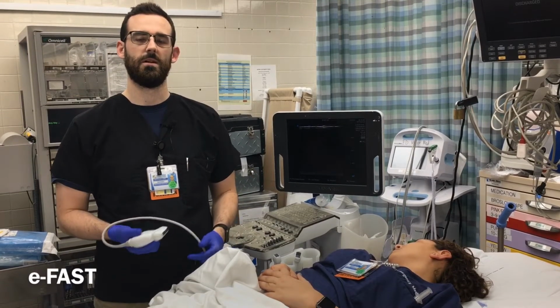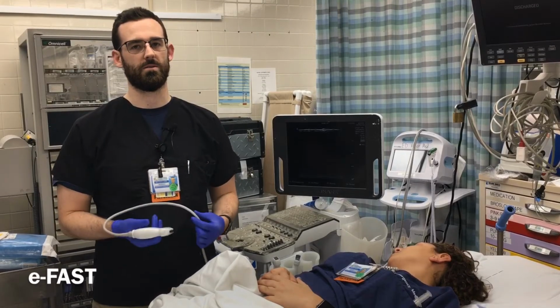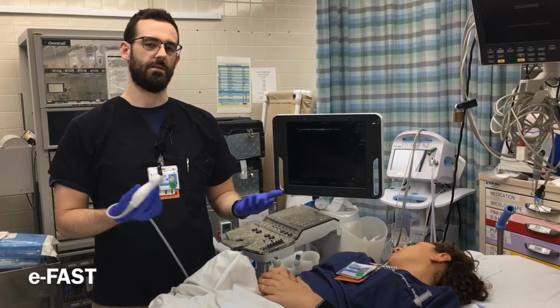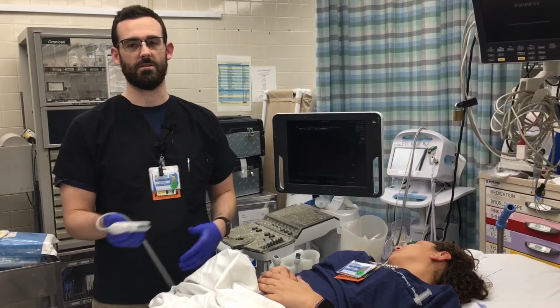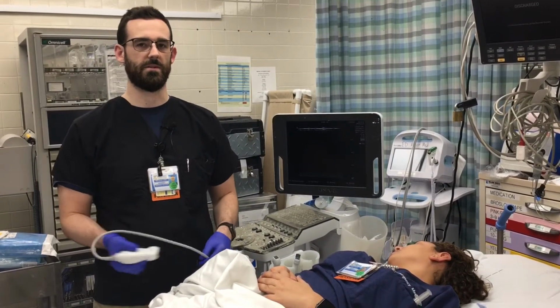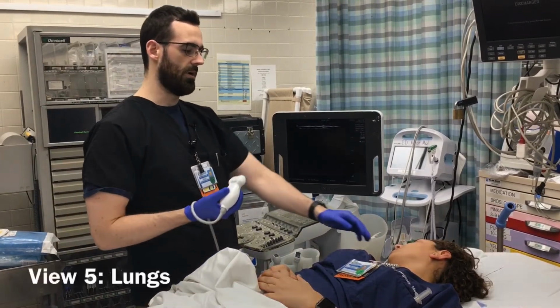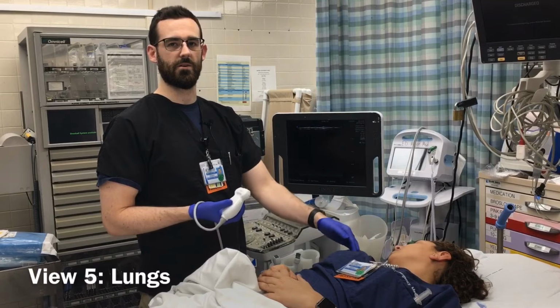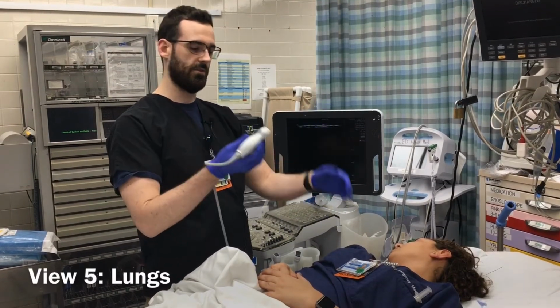The traditional thing is to do just lung views looking for either pneumothorax or pleural effusions. Now, the extended view could be interpreted as you can do any other ultrasounds such as the aorta or the IVC, but today we'll just stick with the lung views and how to do them. You're going to do one on each side. You're going to do the most anterior view, because if there's a pneumothorax, that's where your air is going to rise to.